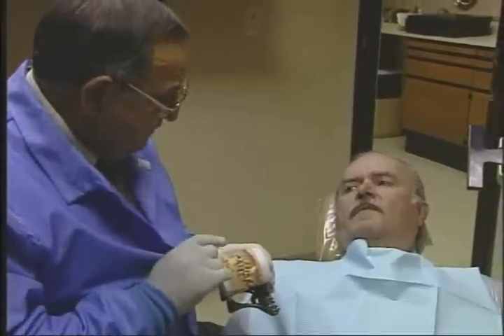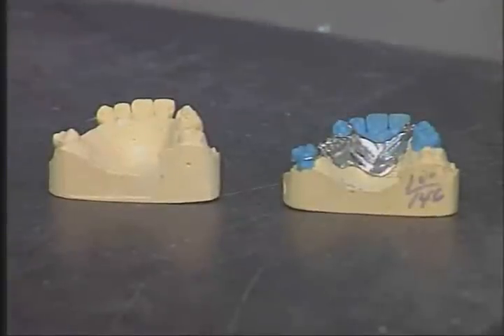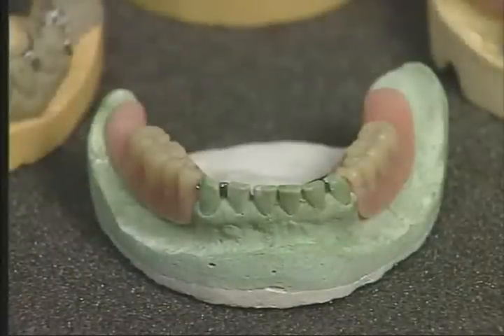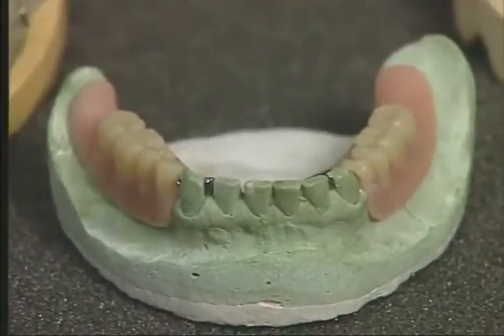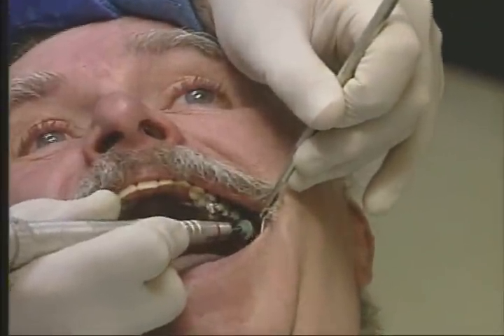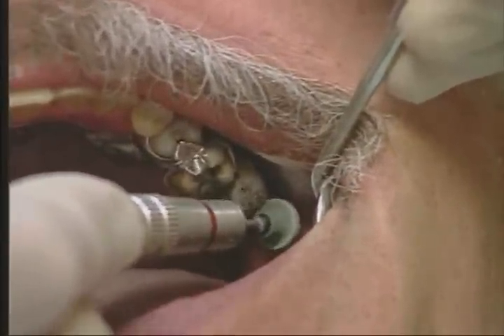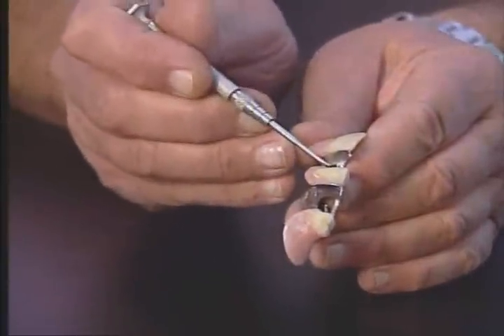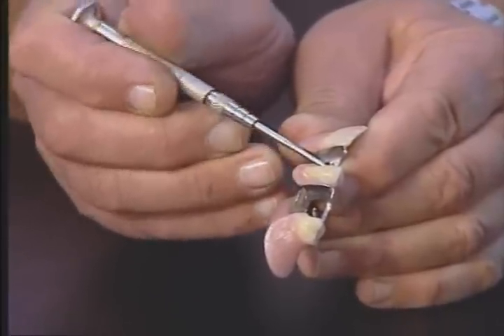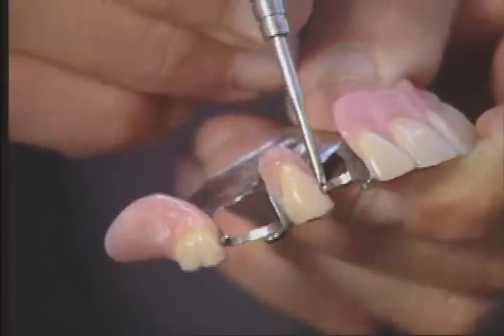All cases should be completed and returned to the doctor on the original master model. Master models are duplicated in the laboratory and all fabrication is completed on the duplicated models. Make sure all undercuts are eliminated on the denture base before inserting the case. Make sure clasps have been freed from acrylic so they can function properly. The dentist should correct all prematurities and overextensions on the denture base and instruct the patient how to remove and care for their prosthesis. Never touch Equipoise clasps with pliers — if added retention is necessary, a specially contoured instrument is placed between the E-clasps and the denture tooth, moving the E-clasp slightly for extra retention.